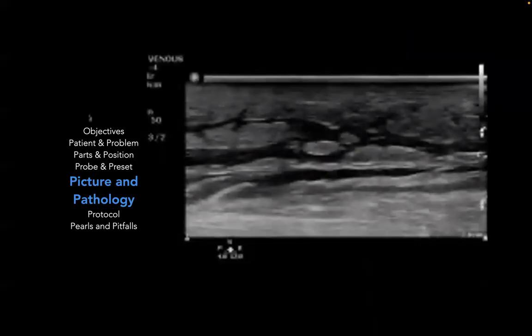In this example, this is a clear sign of cellulitis. There is much more cobblestoning and much more fluid in this picture here. As you may know, cellulitis and abscess are kind of a gradient, a continuum. For a cellulitis that seems to be worsening, there can be more and more fluid until it becomes loculated and becomes an abscess. And in that continuum, POCUS can be really helpful in determining: is this a drainable cavity or not? Is this amenable to an I&D or not?